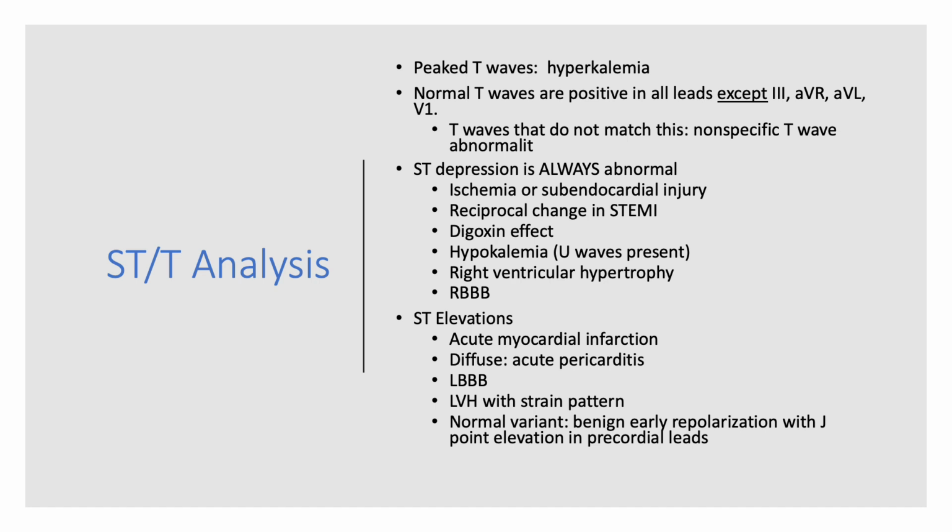When we look at the ST segment and T waves, remember peaked T waves are associated with hyperkalemia. Normal T waves are positive in all leads except leads 3, AVR, AVL, and V1. T waves that don't match that are considered a non-specific T wave abnormality unless there are other ST changes that are concerning for some other pathology.